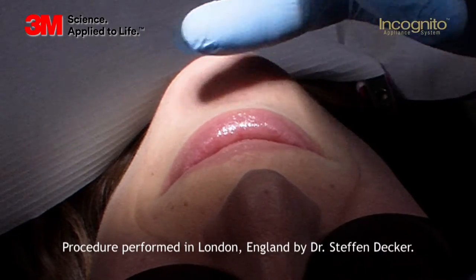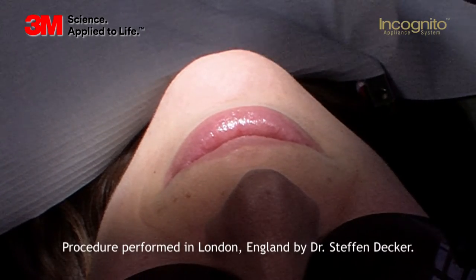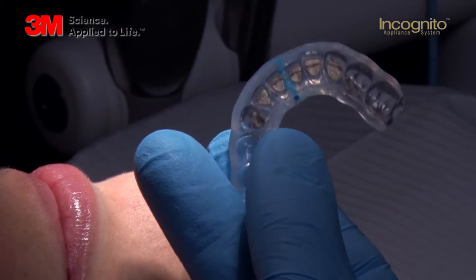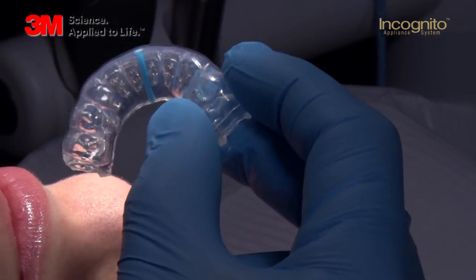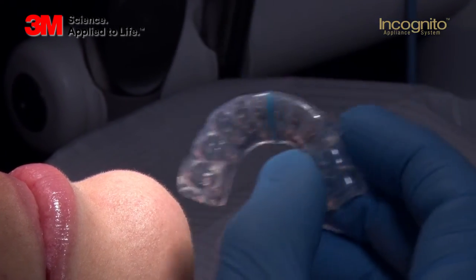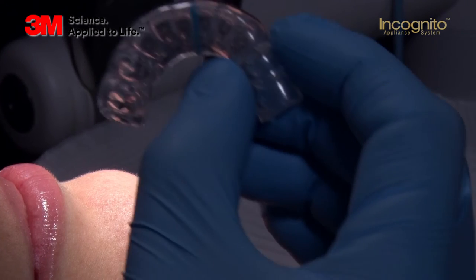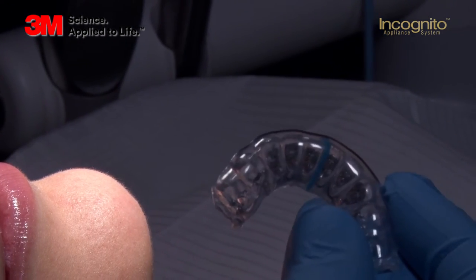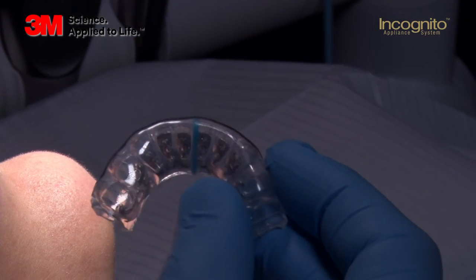Today we're going to bond the lower arch with the Incognito Light appliance. What you can see here is a so-called clear precision tray. This is a digitally made tray which allows me to position the brackets completely accurately on the tooth surface. And this is what we're going to show you now — the bonding protocol for Incognito Light.